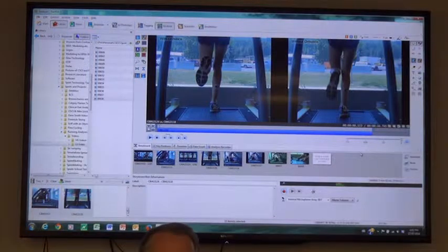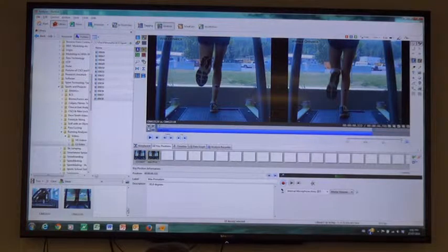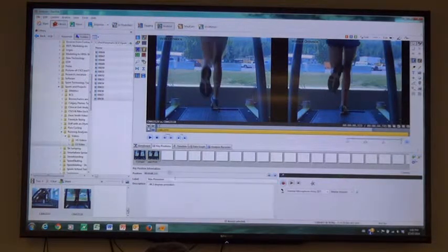Now, from a biomechanical assessment, her orthotics are reducing her pronation by, so we have 91 degrees in one situation and 94.3 degrees in the other situation, by about 3 degrees. So does that mean they just made that tilt on the 3-degree angle? Maybe. It would be very interesting to actually know whether that 3 degrees difference corresponds to the angle that they actually made that tilt on that particular orthotic.